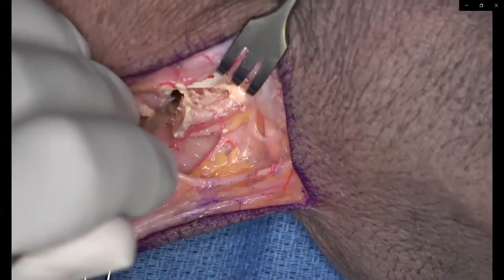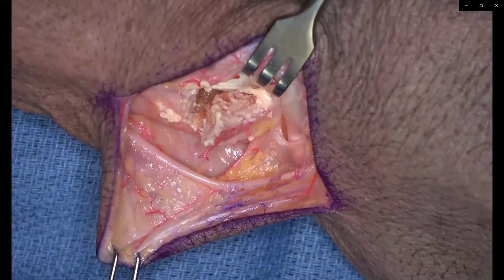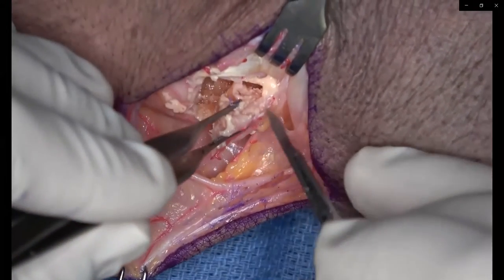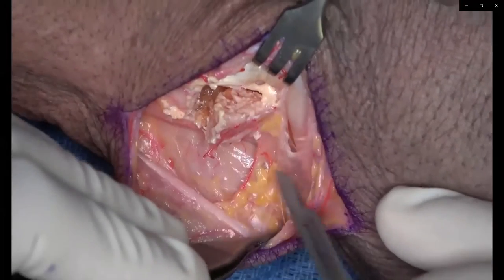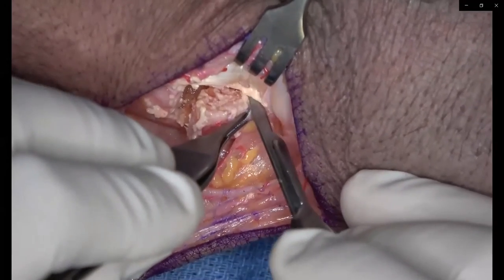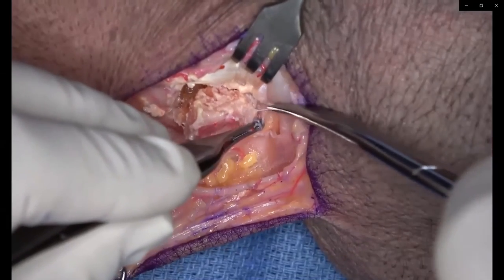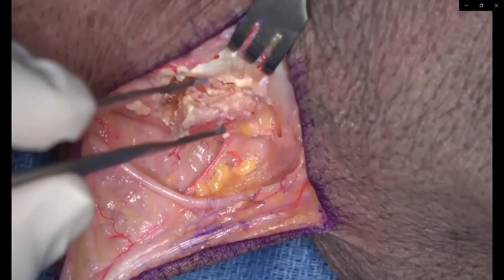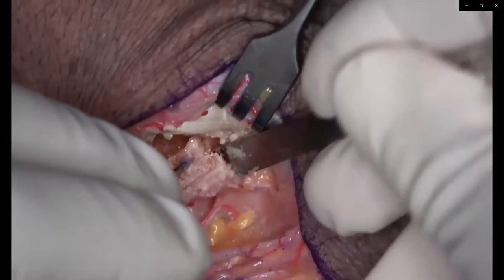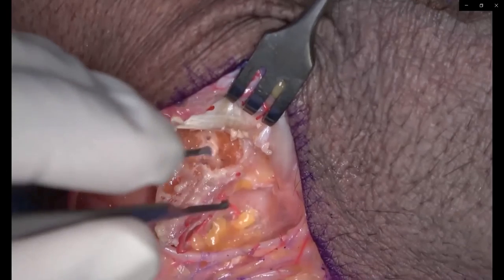One trick is to angle your saw or osteotome away from one another so you don't end up with a triangular graft meeting at the apex. Because of the convexity of the bone here, you want to make sure you do not meet in the middle and create a triangular graft. This shows elevation of the bone graft — I actually like to go in and make a subperiosteal incision distally and make a cut underneath the pedicle so I can make a precise rectangular window in the cortex.